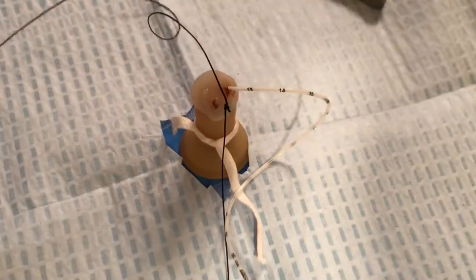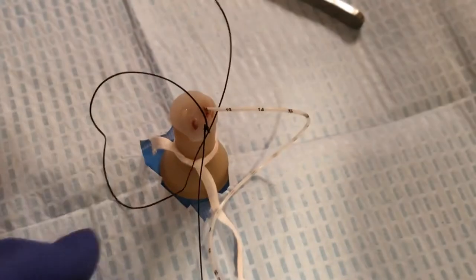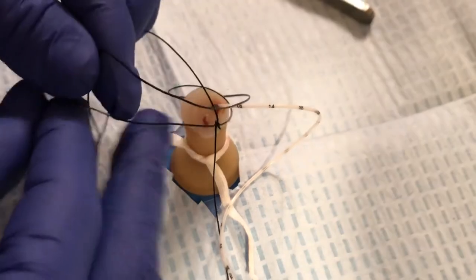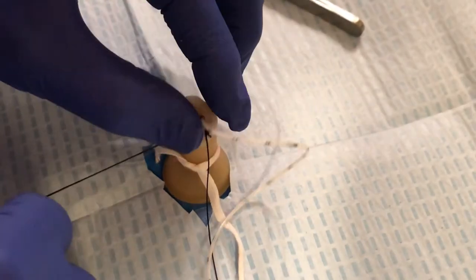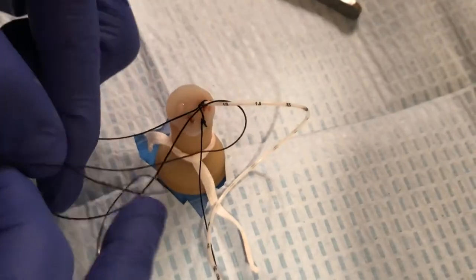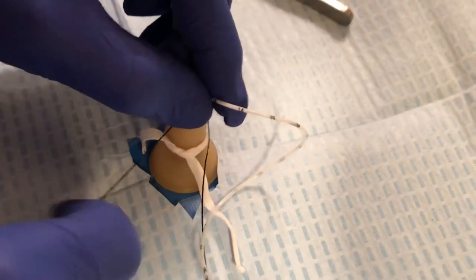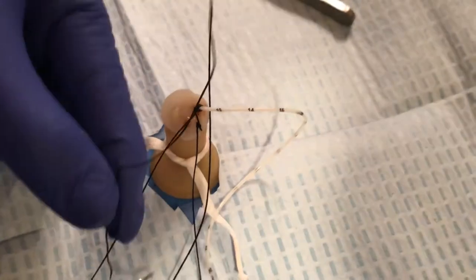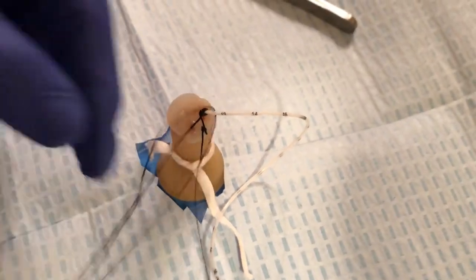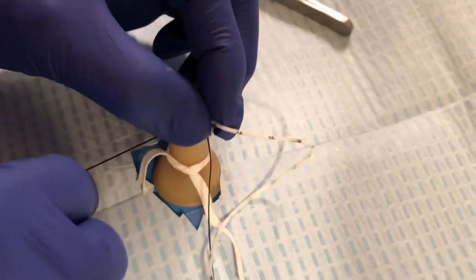Next, we are going to perform four hem or slip stitches individually around the umbilical line. Going around and through — there's our first slip stitch. Again, around and through — for our second slip stitch. Around and through for the third, and then the fourth slip stitch.